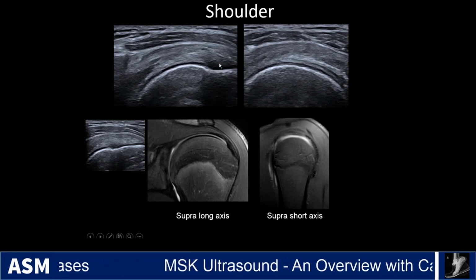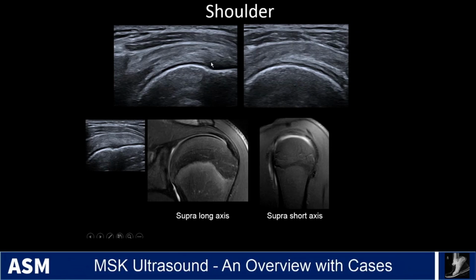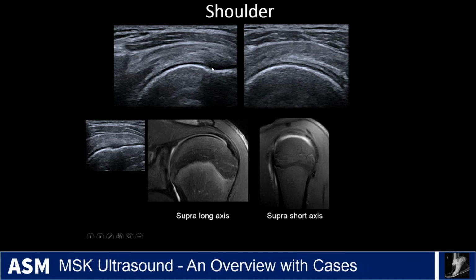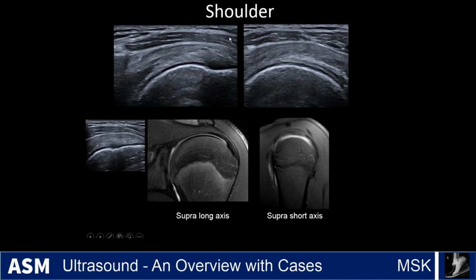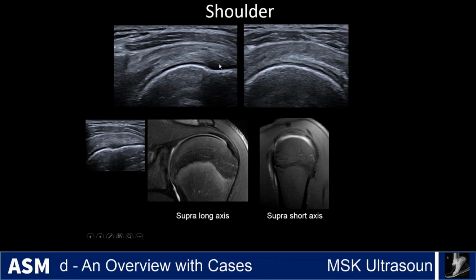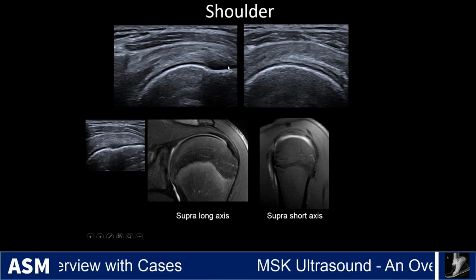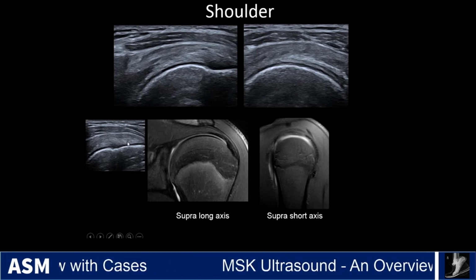And you notice that there is this hypoechoic region right at the footprint here. And you often see this, and this may be a tear and this may be anisotropy. So you want to then come over and try to sit right on top of that footprint and rock the transducer and see if that fills in. And this is the same tendon as you come over the footprint, you can see that fills in. So this is anisotropy here. There is no real tear there.